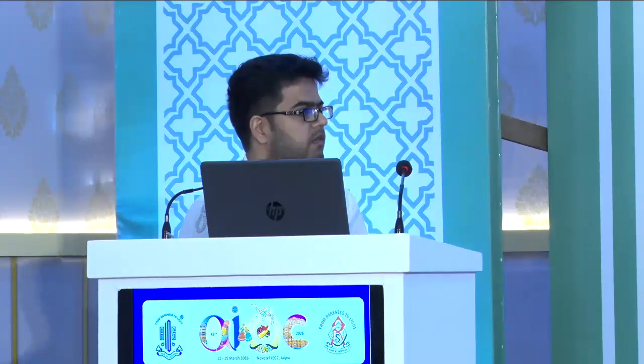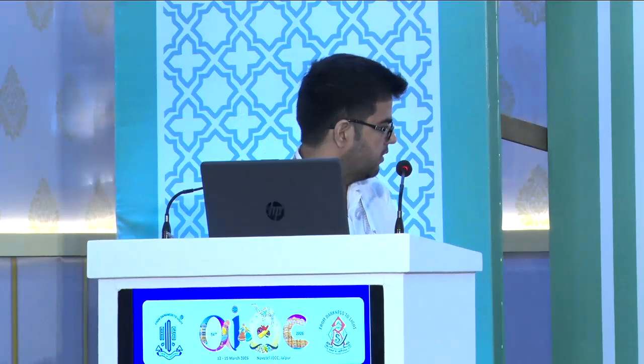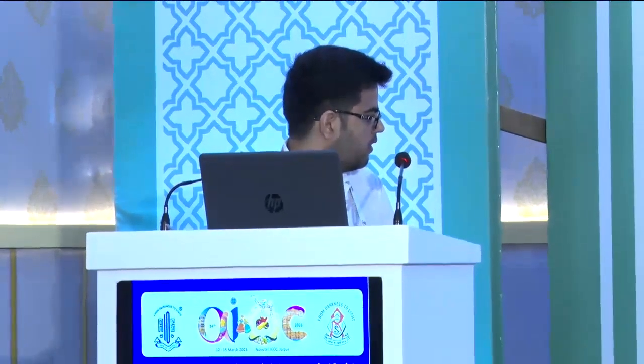So suppose, doctor, I say that this is old wine in a new bottle. There are multiple such smartphone adapters. What is so special that we would like to purchase one for our clinic? Yes, so the main USP is that with any other adapter, if you attach it, it permanently occupies your eyepiece. So you cannot use the slit lamp separately, and you cannot use the mobile separately. But this has the ability to flip. So once not in use, you can flip it, and it is magnet based, so you can use your mobile just after that.